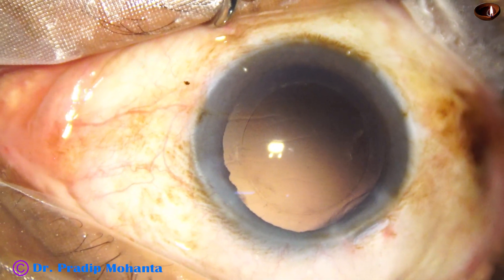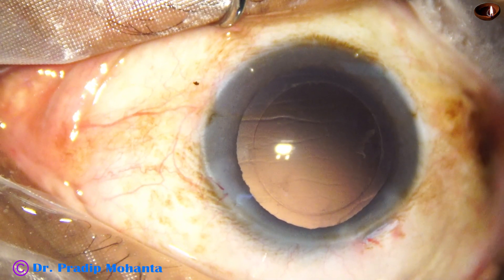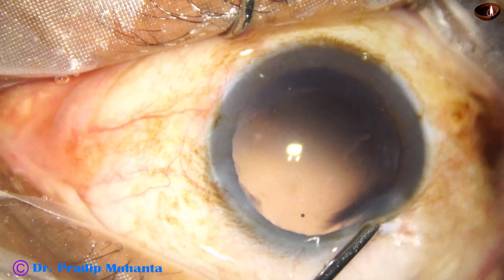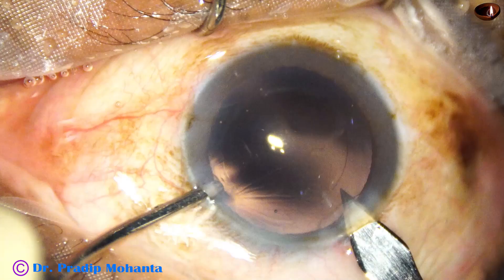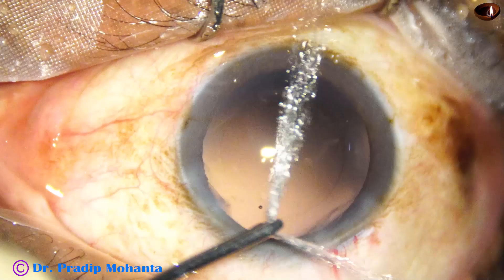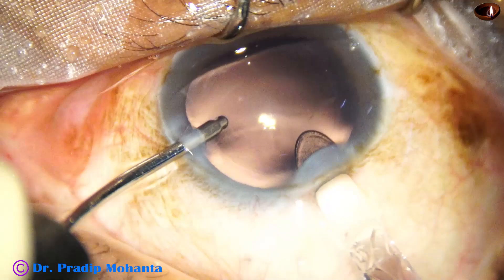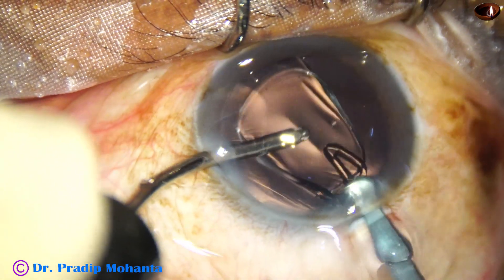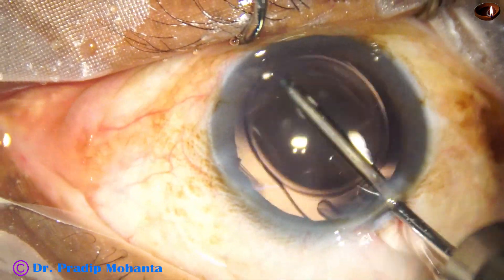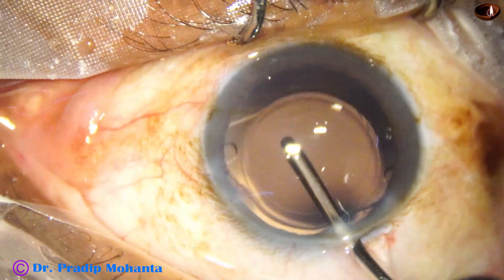Cortex has been nicely cleaned by the handpiece itself. Now we are going to implant an intraocular lens. We are going to use a B cartridge, so the main wound has to be enlarged to about 3 millimeters. Engage at one side and do two cuts to get a 3-millimeter wound. Here goes the intraocular lens. The leading haptic goes in the capsular bag, and the trailing haptic is pushed by the left hand irrigation probe into the bag. The irrigation probe is used to dial the lens.